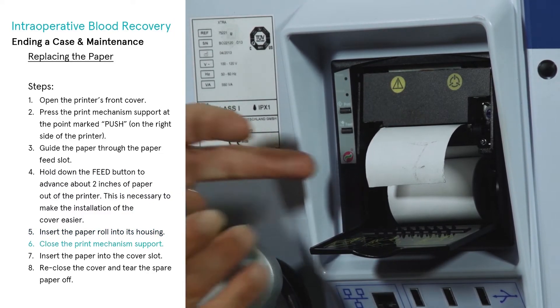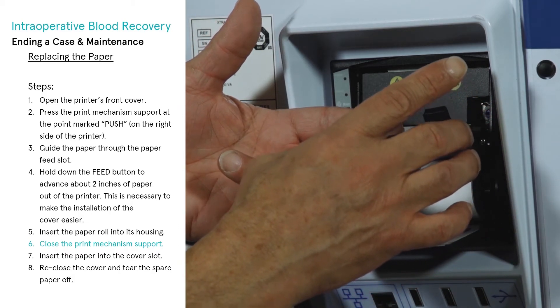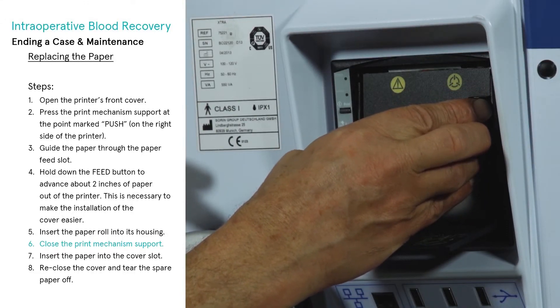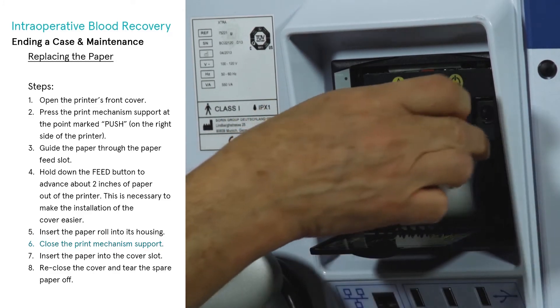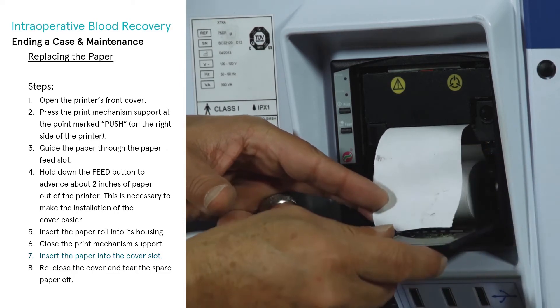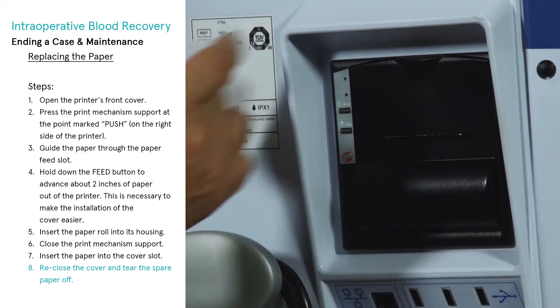Insert the paper roll into its housing and close the print mechanism support. Insert the paper into the cover slot. Finally, reclose the cover and tear the spare paper off.